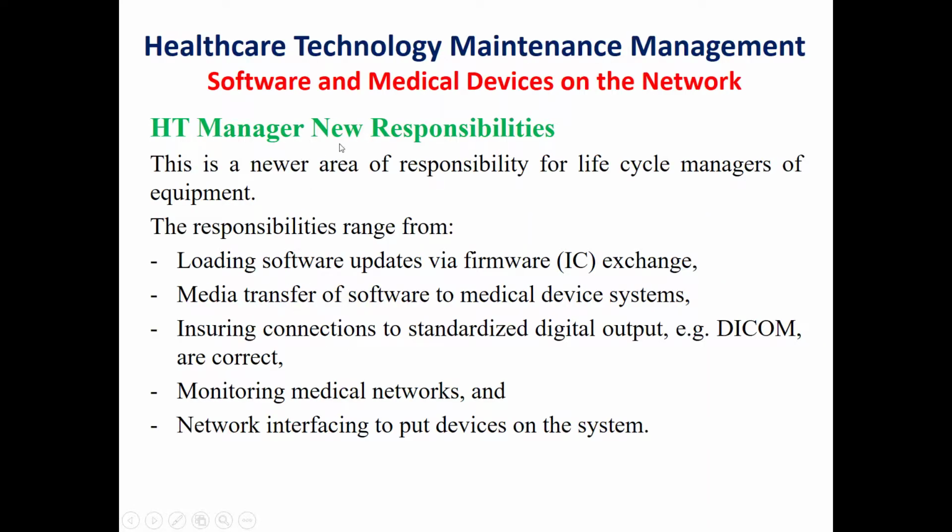Now we'll move to the last point in the healthcare technology maintenance management, which will be the software and medical devices on the network. New responsibilities will be included for the healthcare technology manager.